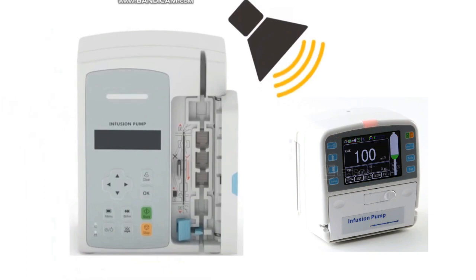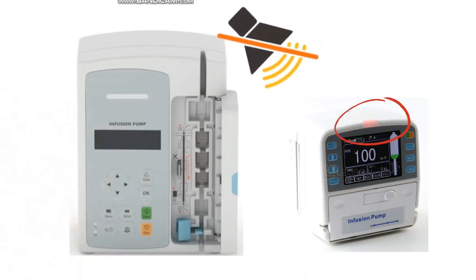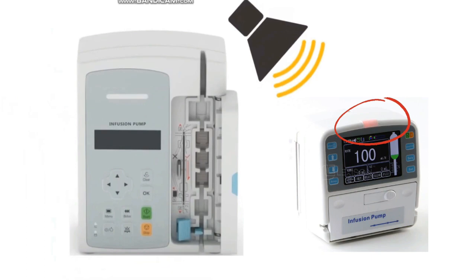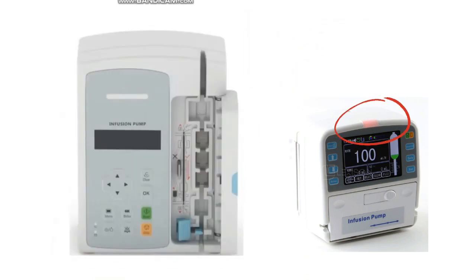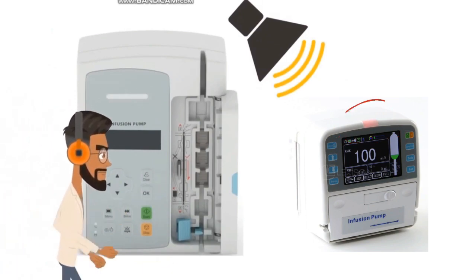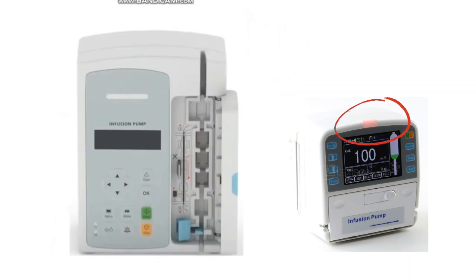Alarms determine if there is a problem with the machine. The most common infusion pumps include both visible and audible alarms that allow them to identify any problem during operation. When the drip chamber detects an increase or decrease in the planned flow, the drip alarm is activated. The sensor detects the presence of air inside the infusion tube and sounds an alarm. When equipment is unplugged from the electrical network and begins to function on batteries, an alert is also triggered. The system detects an obstacle between the pump and the patient and alerts by occlusion.